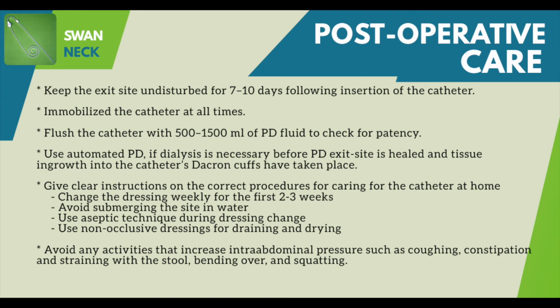During the post-operative care, it is important to keep the exit site undisturbed for 7-10 days following insertion of the catheter. If during the first 10 days the dressing becomes soiled, it should be redressed by a nurse. If it merely becomes dislodged, it should simply be replaced with a fresh sterile dressing. During this period, the catheter tubing must be immobilized by securely taping it to the patient's abdomen.